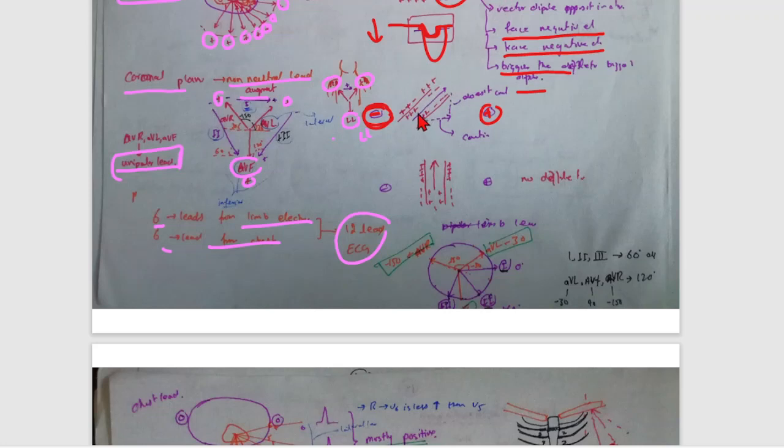Okay, so what will happen? If the dipole is moving like this, what will happen? You have to make the shadow of this line on this direction, so it will only show the shadow of this direction, only the part of this direction that is like this. So first of all, you have used this mechanism to find their direction in this way, and it gives you a deflection that is called simple deflection.